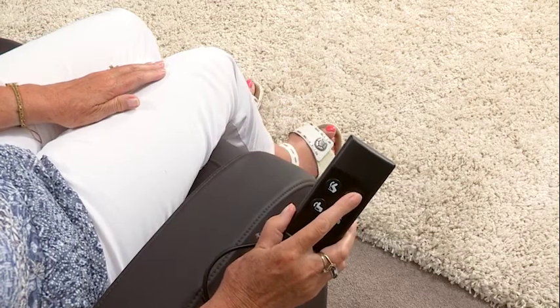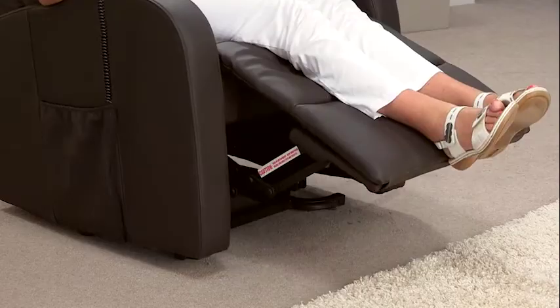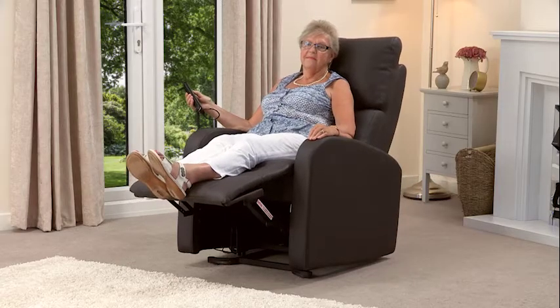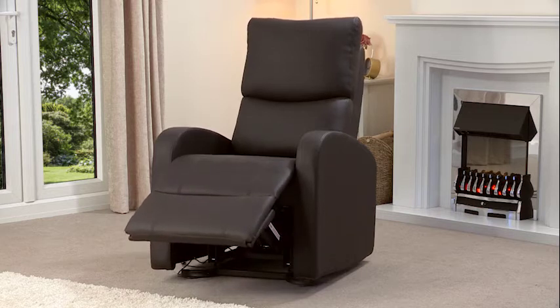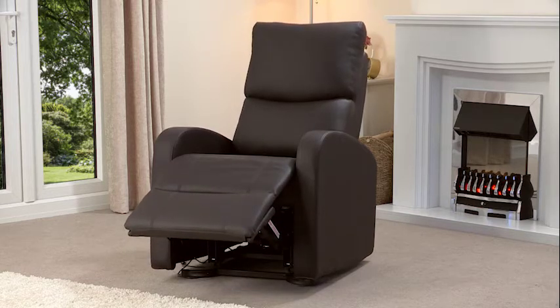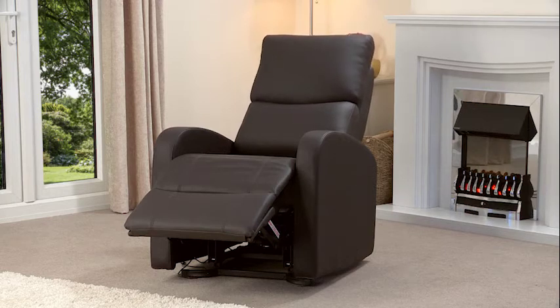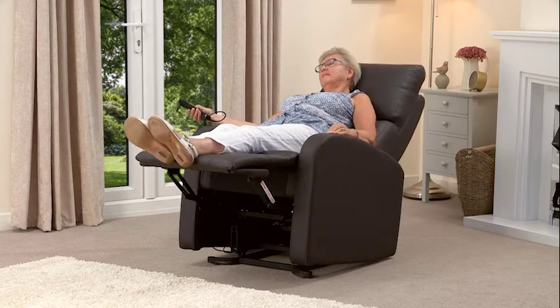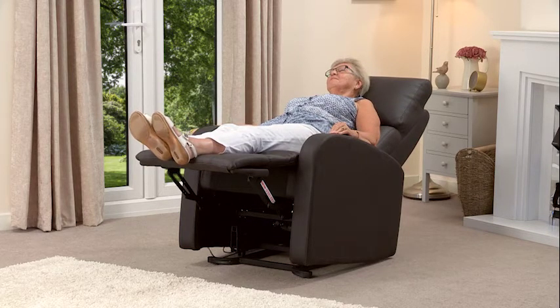From here you can raise the footrest independently and put your feet up while you keep the back in an upright position. This chair features a dual motor which allows you to operate the leg rest and the back rest independently so that you can find the perfect comfort position. If required, the chair can then be fully reclined into an almost flat position, which is ideal for snoozing.